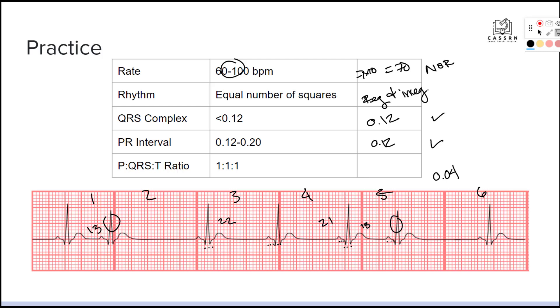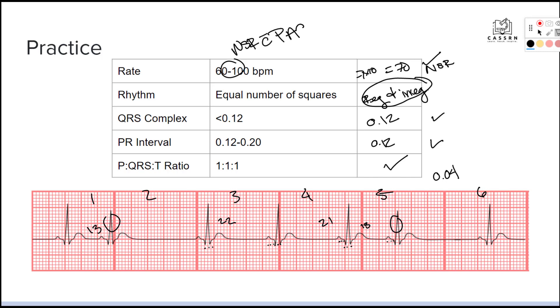Then we check our PQRST ratio — do we have all of that? We've got PQRST, PQRST, PQRST — so that is also normal. Coming back to reevaluate: the rate is normal, the rhythm is irregular due to the PACs, and everything else is looking normal. So we're going to call this a normal sinus rhythm with PACs.